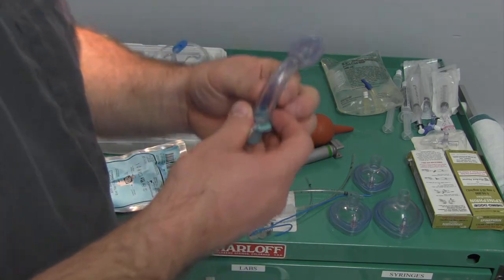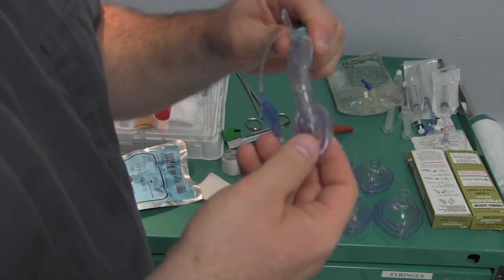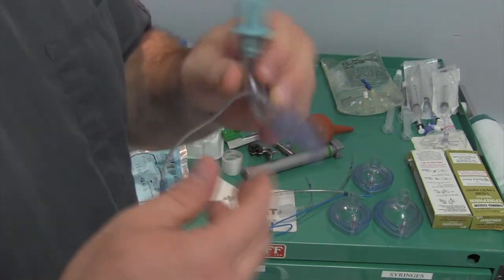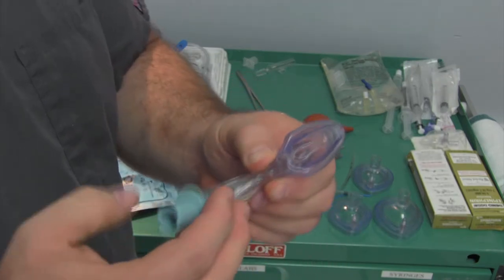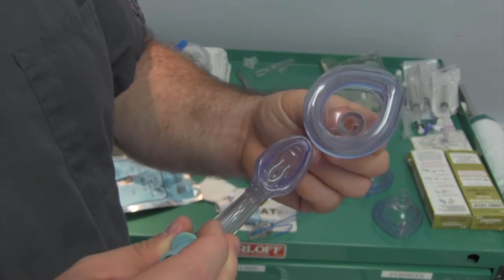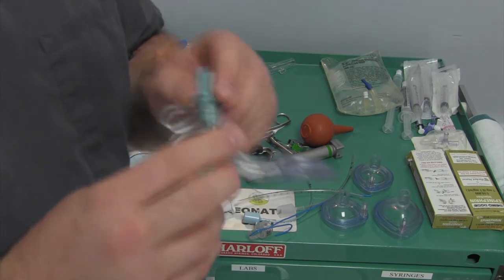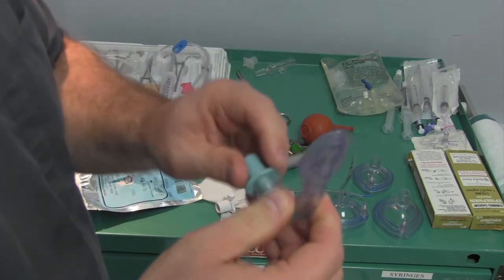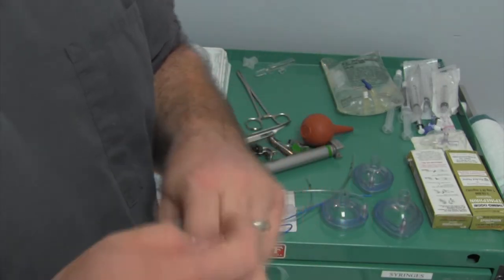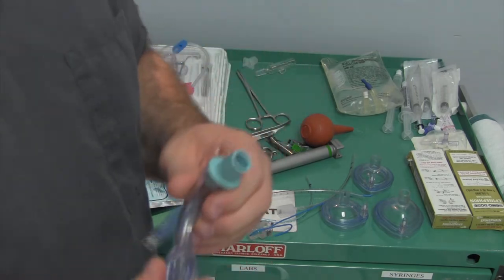Bulb suction - we also have these as part of our neonatal resuscitative kit. This is a neonatal LMA called an AirQ. This would be used in a situation where we couldn't get an endotracheal tube in. We could insert one of these and it would essentially go down and fit right over top of the glottis. This would work for ventilation - not perfect, couldn't go on a vent with it, but it could work for resuscitation. You'd only use it in a situation like a Pierre Robin or something with a baby that has a small jaw or recessed lower jaw that might be really difficult to intubate.